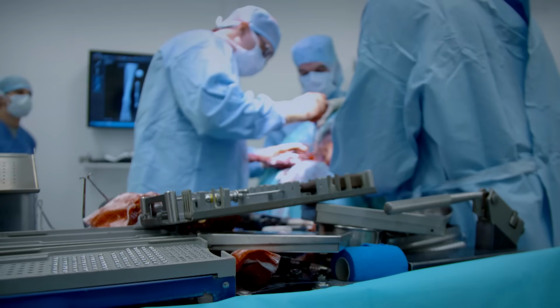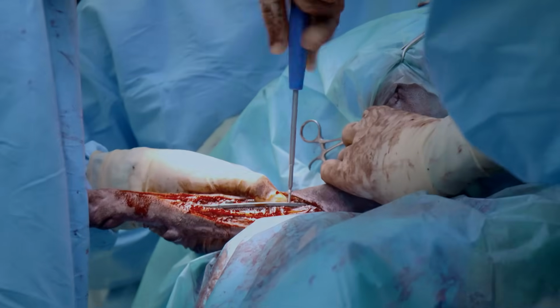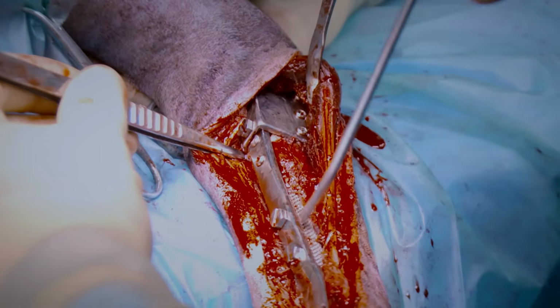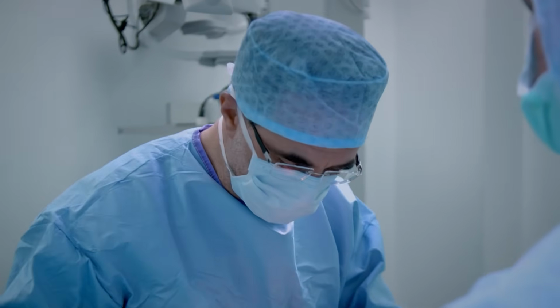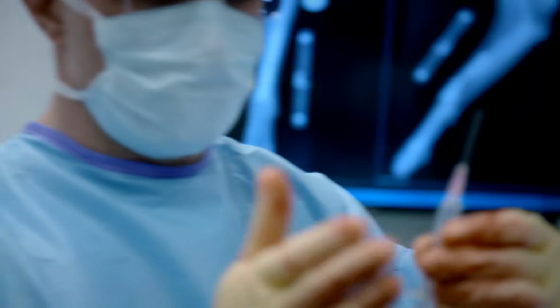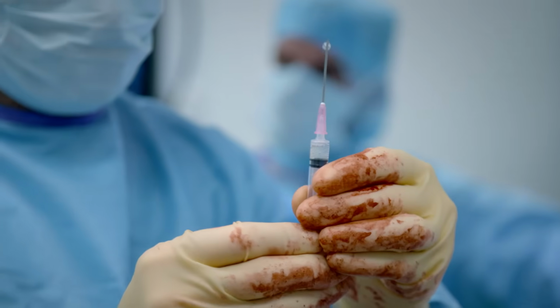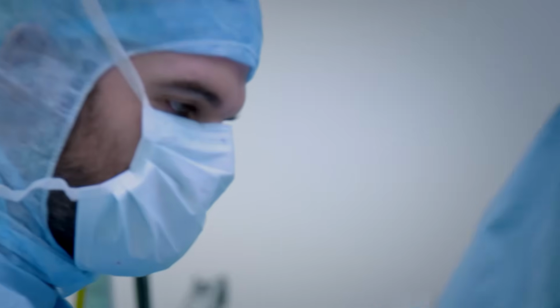Finally, Noel is able to screw the implant into position with the mesh perfectly lined up to bridge the gap in Izzy's leg and fuse her wrist. Next step is the big step, of course, where we inject the biological soup of growth factors and cells that's going to help the bone at the top to grow through the metal and join the bone at the bottom. Here we go. Turn on the air.